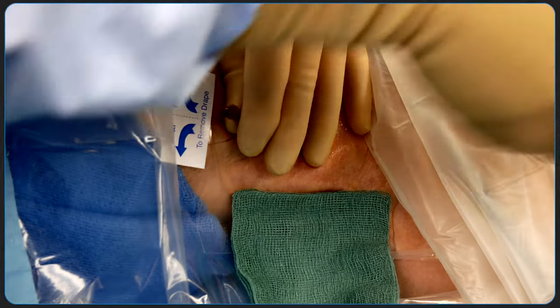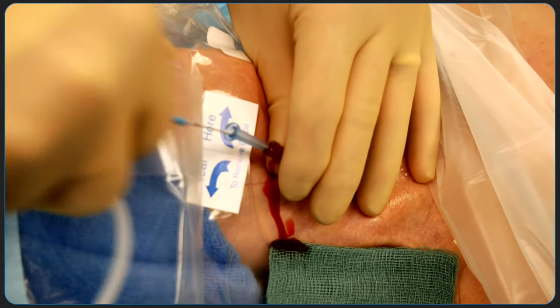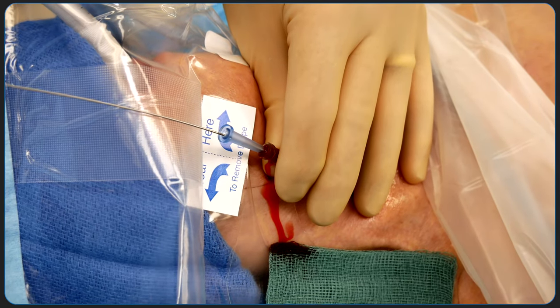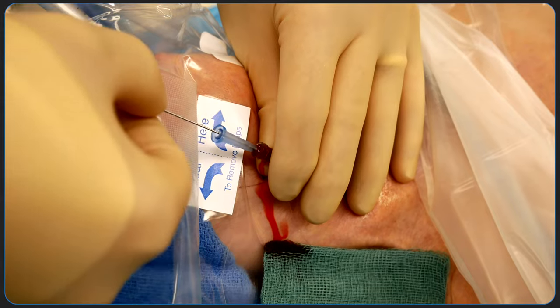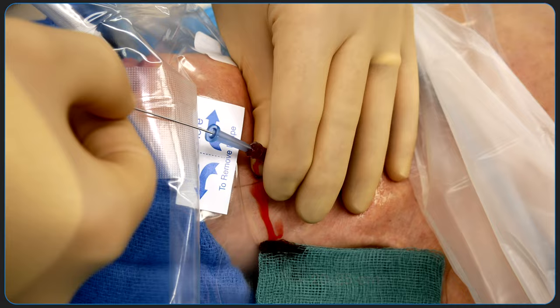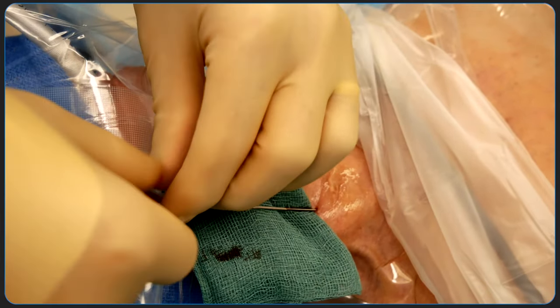The syringe is then carefully disconnected from the needle and a 0.89 mm J-tip guide wire is threaded through the hub of the introducer needle. The guide wire should not encounter any resistance with advancement. Depending on the patient's height, advancing to 20–25 cm is typically adequate. One should be cognizant of the EKG, as the wire can trigger arrhythmias.